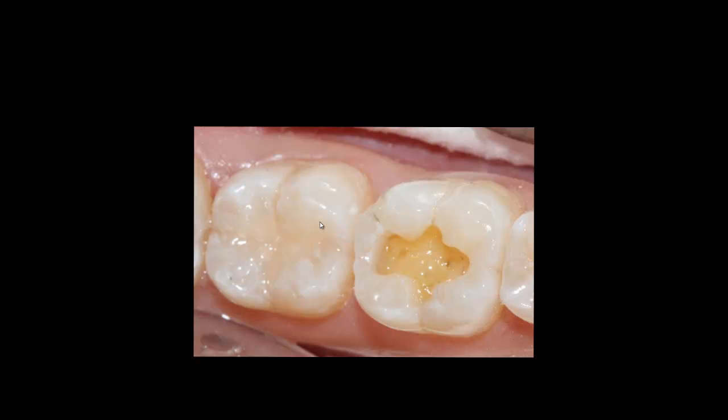The key point here is to reduce post-operative sensitivity after placing the composite. Make sure the bonding agent does not pool at the bottom or in other applied areas. Make sure it fully evaporates before you start placing the composite — this is critical, because residual solvent will diminish the bond and increase sensitivity.